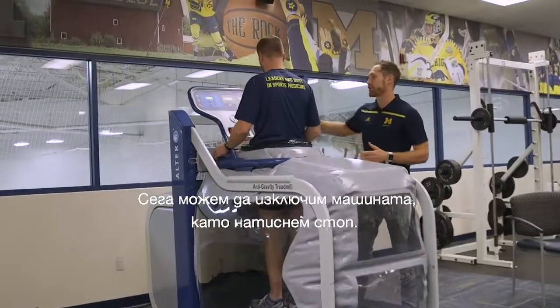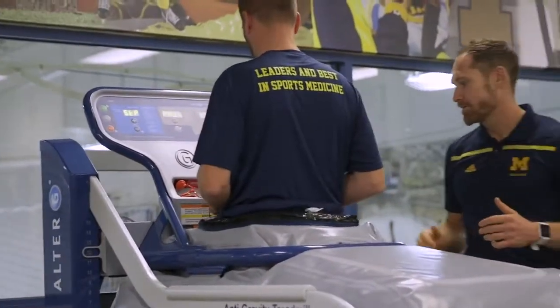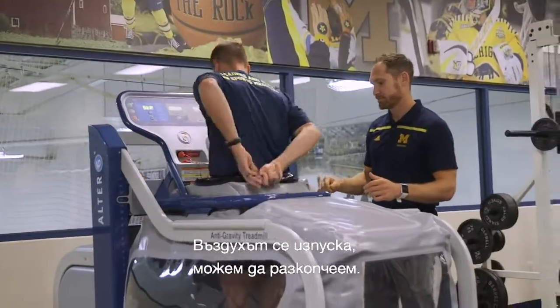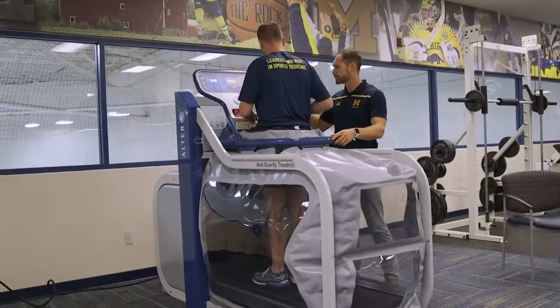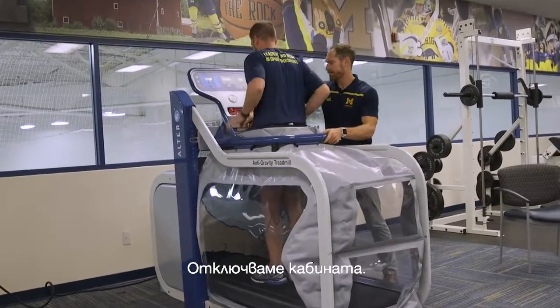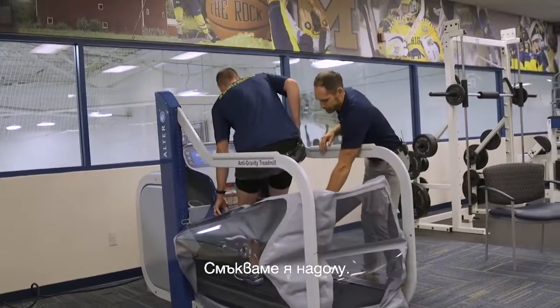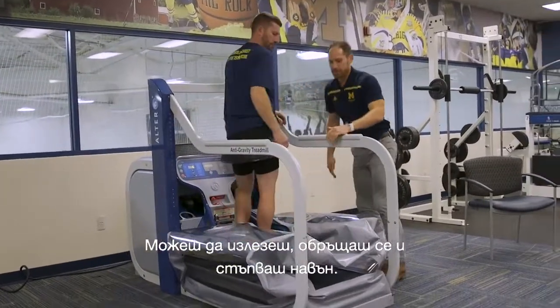At that point we can shut off the machine by hitting stop. As it deflates, we can unzip, unlock the cockpit, lower it down, turn around, and step on out.